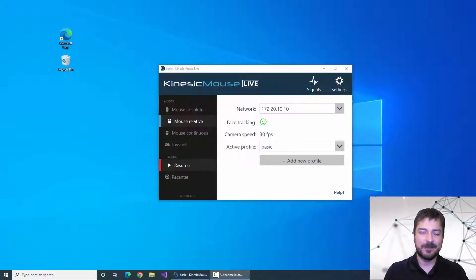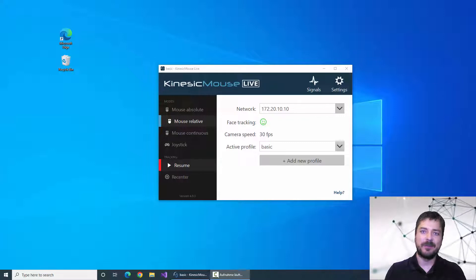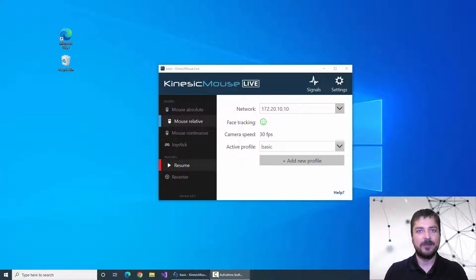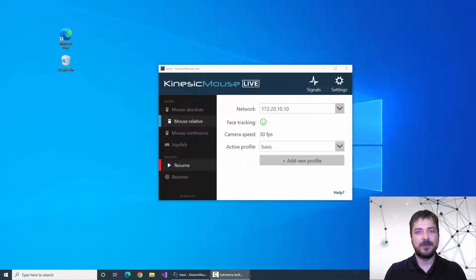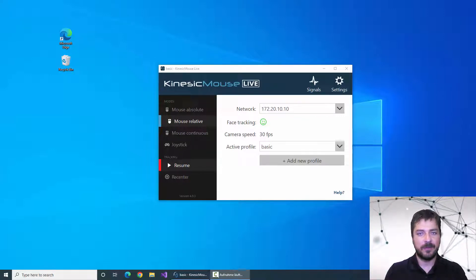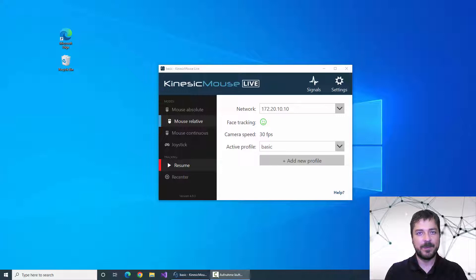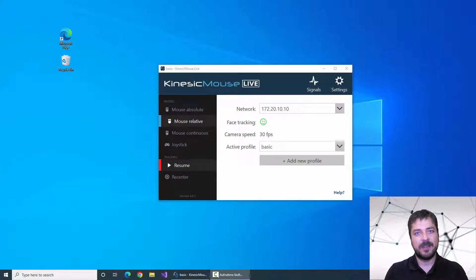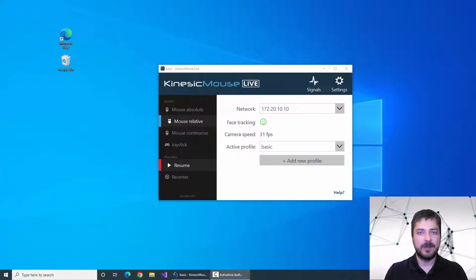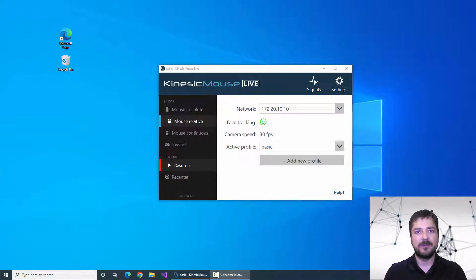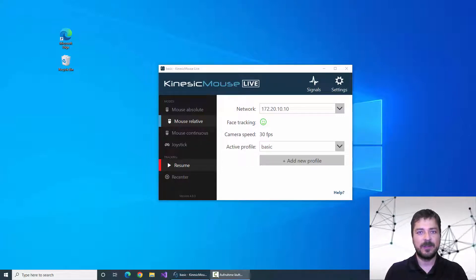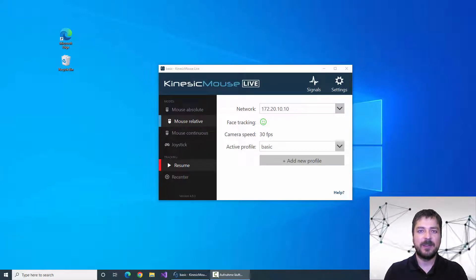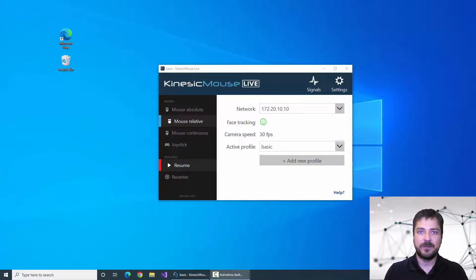The click switch menu is a perfect solution if you only have a few facial expressions to work with. So if you're just starting out with the Kinesic Mouse and gaining control of your mouse buttons, the click switch might be the ideal solution for you.